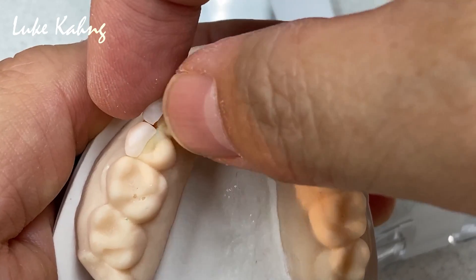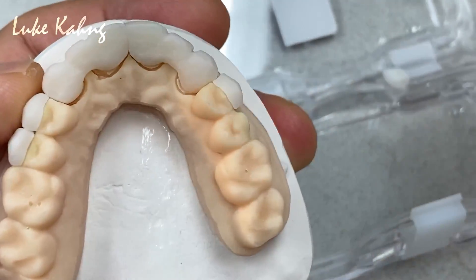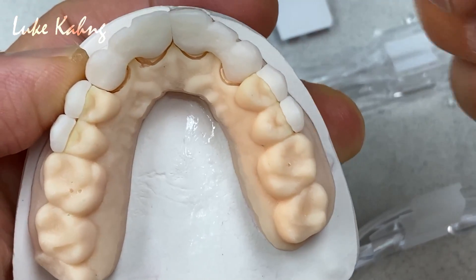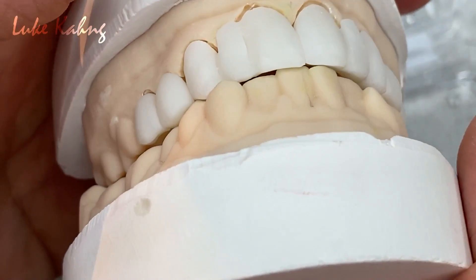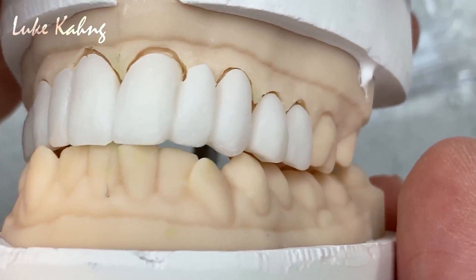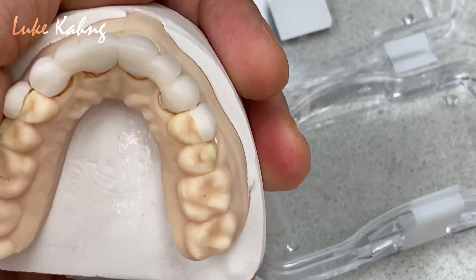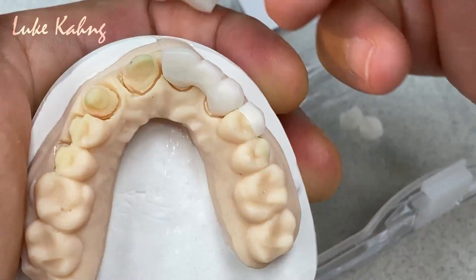You see the full amount of the contour — the facial contour. Made full contour wax-up on the facial contour so that I can see this side; otherwise you cannot see. That one is good. Now apply the porcelain — just a little bit, then grind it, and then I can finalize it for the final work. That's how we control these cases.